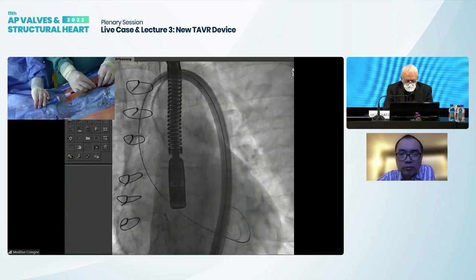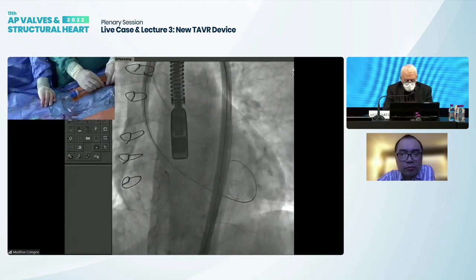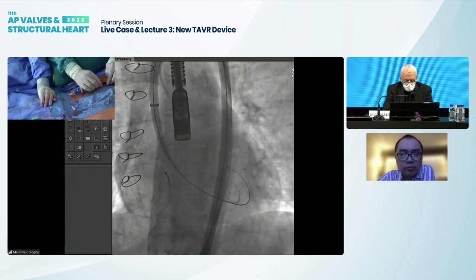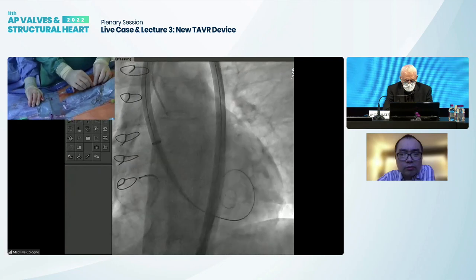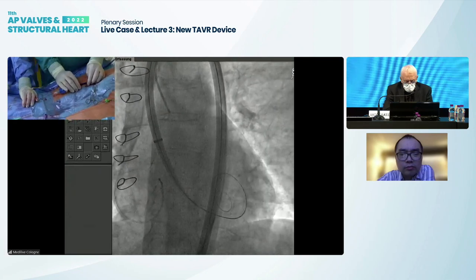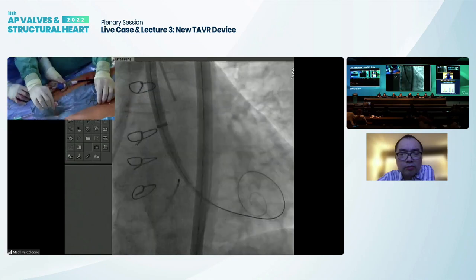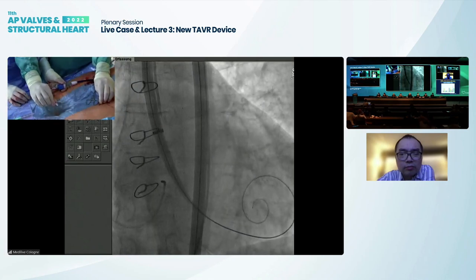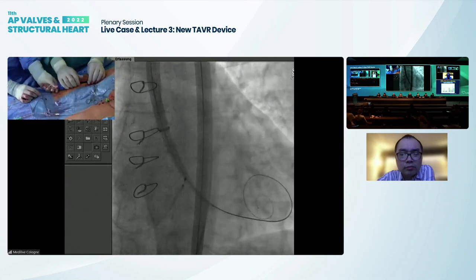And perhaps, Dr. Kerr, perhaps you can remove the echo system a little bit. And we want to keep it right at the STJ here. I think this is fine. We can give a little puff of contrast so that everybody can appreciate that we are right. Yeah, looks like STJ. All right.